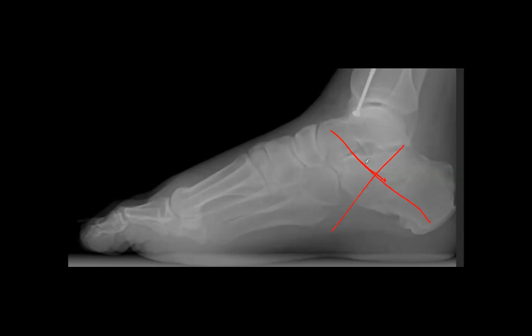And it really does depend, because if you get a joint depression fracture fragment where the posterior facet sits like this and just tips down more posteriorly and flattens out, it's going to give you a much different angle than if you have a posterior facet where the front tips down and it's pointing more inferior.